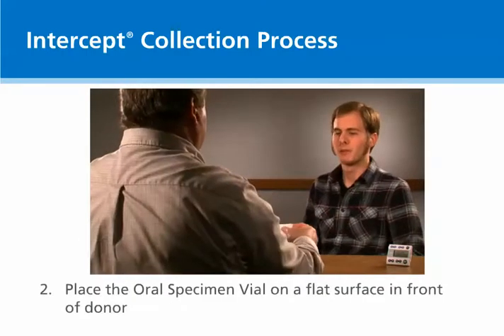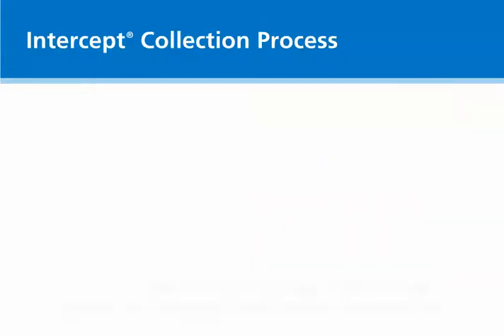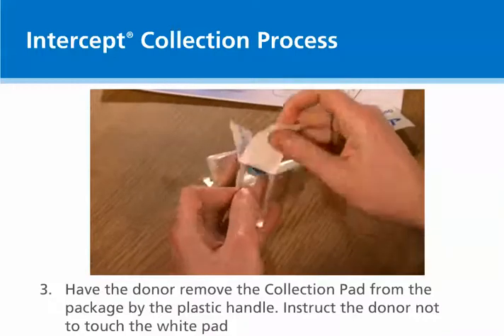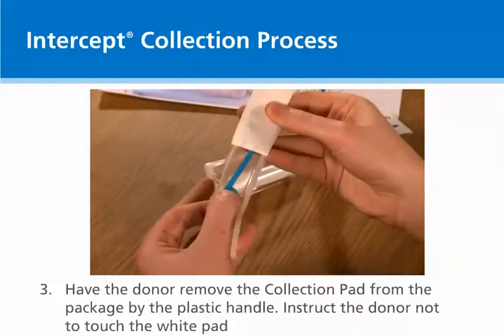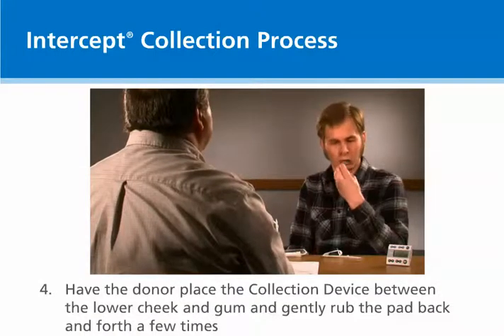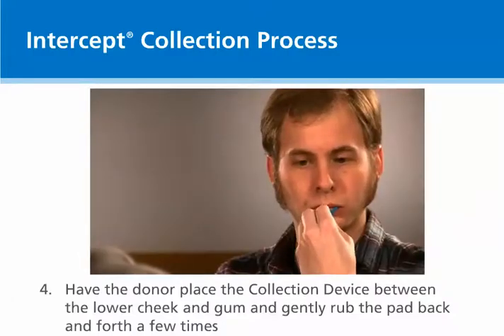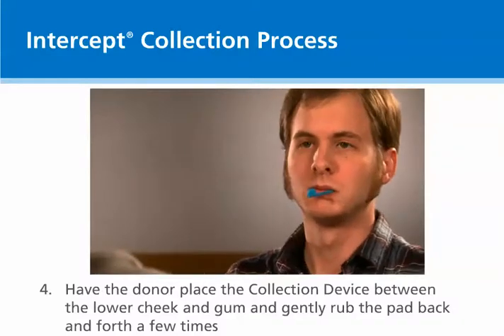Place the specimen vial on a flat surface in view of the donor. Open the outer package. Have the donor open the inner package and remove the collection device by the plastic handle. Have the donor place the collection device between the lower cheek and gum with the blue flag facing up. Then, gently rub the pad back and forth along the gum line until the pad is moist.